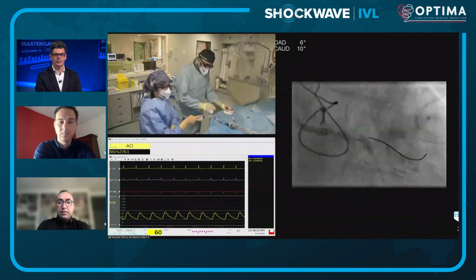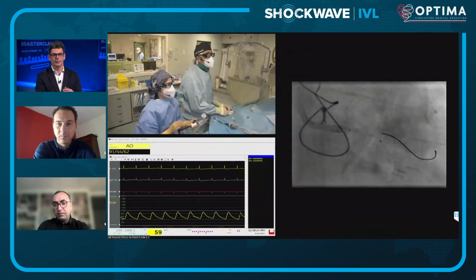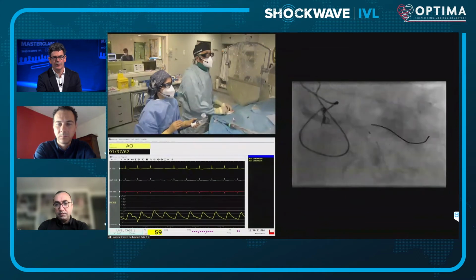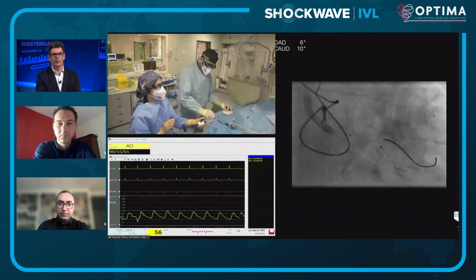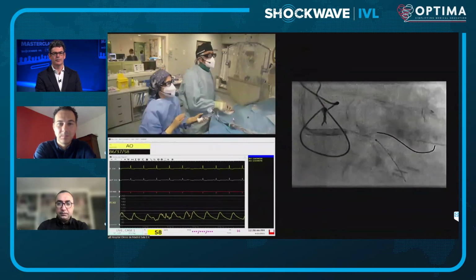Well, it's improving a lot. I'm just bringing it a bit more proximal. Again, it's the wire. I don't know if it is performing any scoring, but what I can tell you is that it's helping us in understanding also the location. Because we still need to open it up a little bit. So we still need to go a bit more proximal.